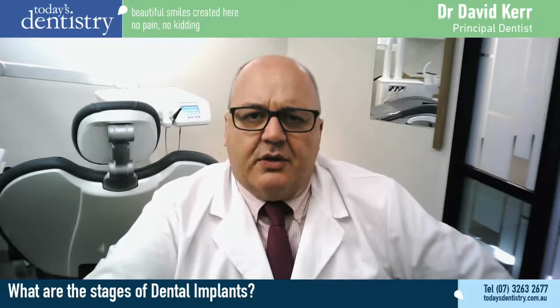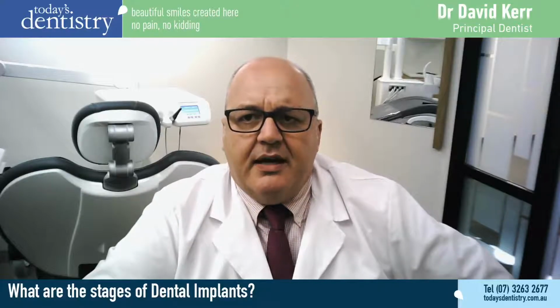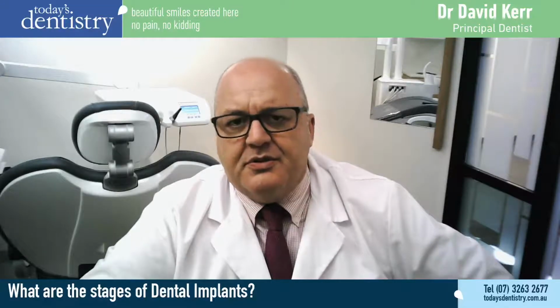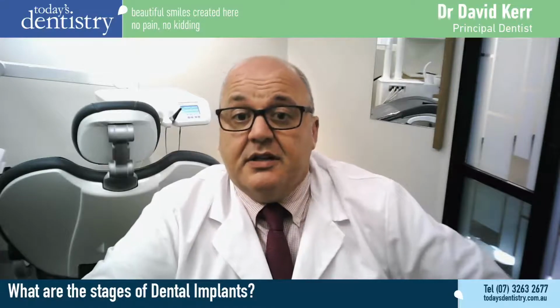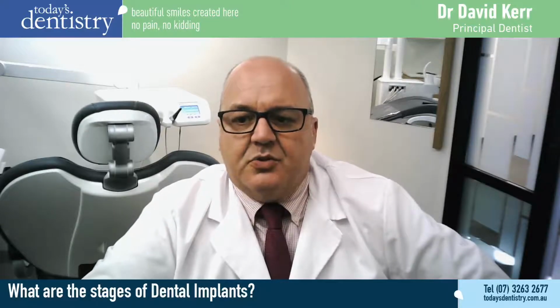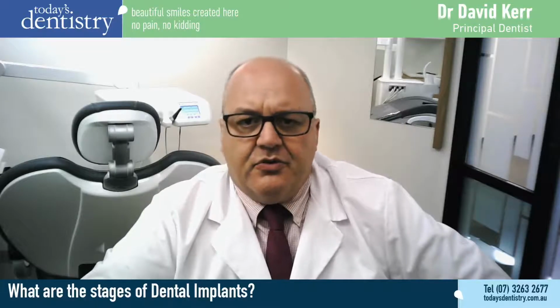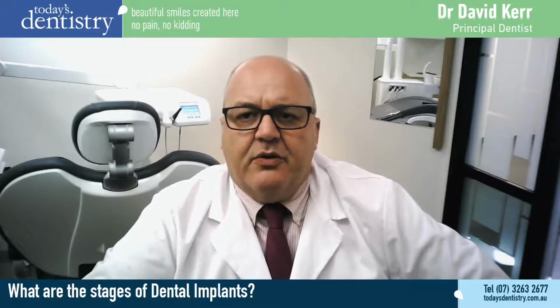That process is critical. Stage 2, if everyone's happy with that, we usually go ahead and discuss this in far more detail, and we've obviously got to introduce some different options and costs and talk about alternatives as well that you do need to consider before you can make your decision. Stage 3, if you're happy with all that, is the actual surgical procedure itself. This is done in a sterile environment with drapes, etc., where we place the implants basically where we've planned them.